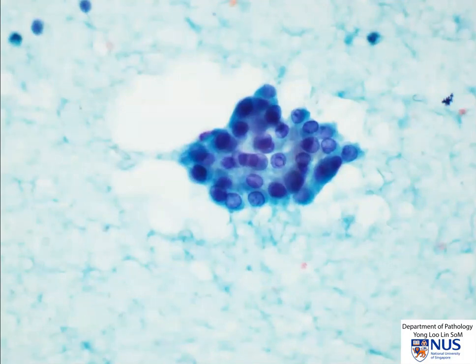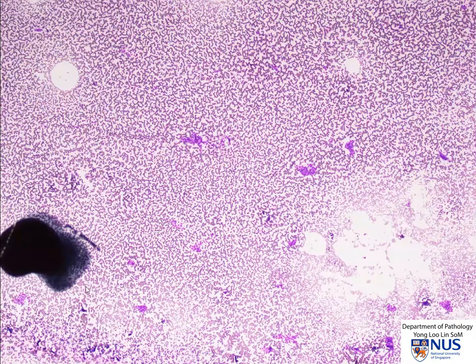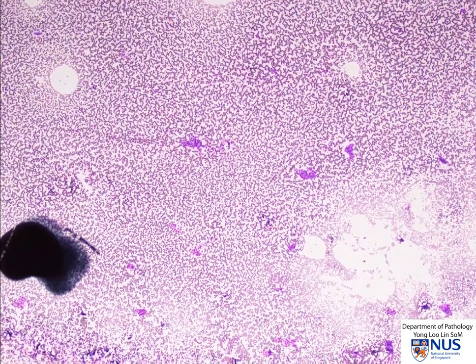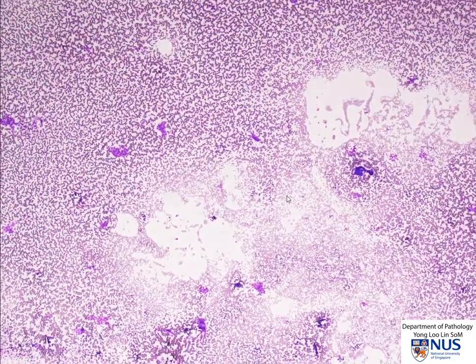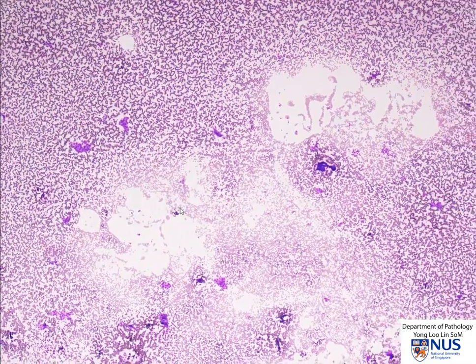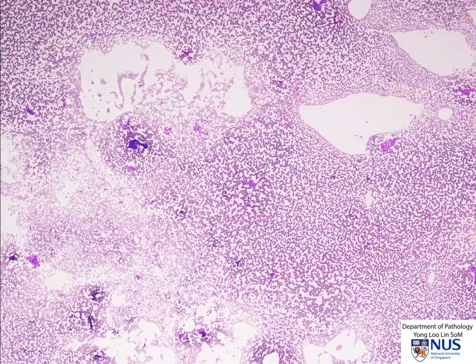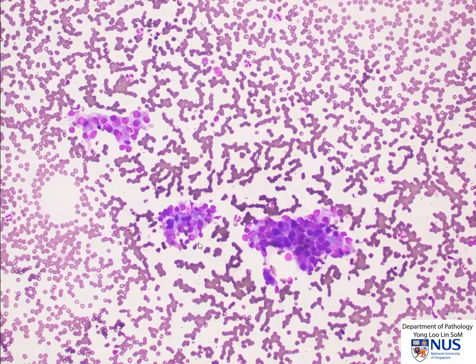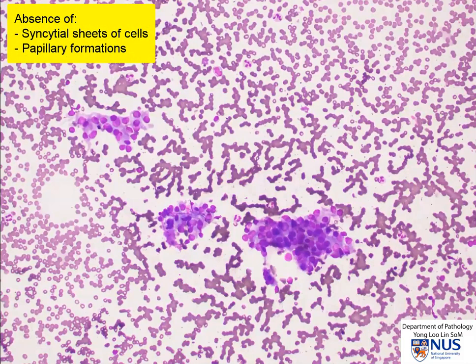Let's move on to have a look at the air-dried smear. At low power magnification, there is a similar repetitive appearance of small tight clusters with a suggestion of micro follicular formations. Some of them look as if they are in the form of small elongated trabeculae. Again, we have the apparent nuclear crowding, but we do not have syncytial sheets of cells or papillary formations.